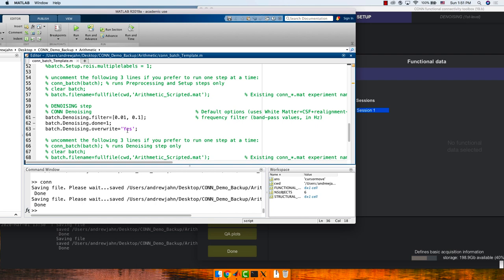Just be aware: what I have here is a pretty bare-bones template. But if you simply replace the number of subjects with however many subjects you have in your current directory and point toward where the functional and anatomical images are, it's going to run through everything start to finish from this script. You don't have to do anything else besides that.